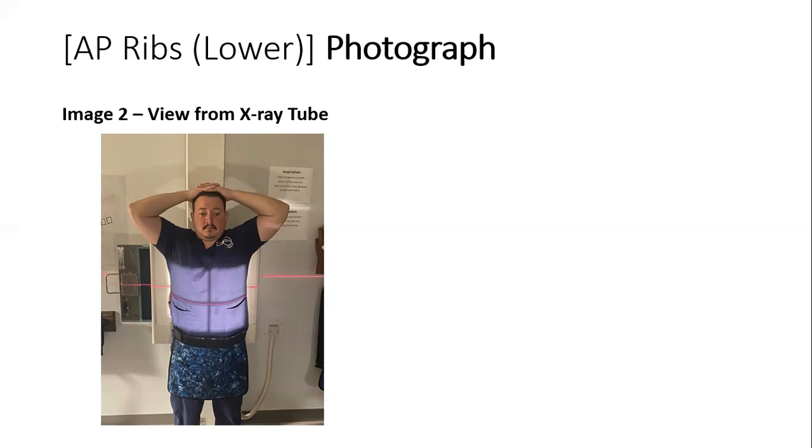The visual of appropriate marker location for this should be anywhere on the left or right of the lower abdomen, so long as it is not in the anatomy of interest. The kVp range for our real patient for this image should be anywhere between 75 to 85 kVp.